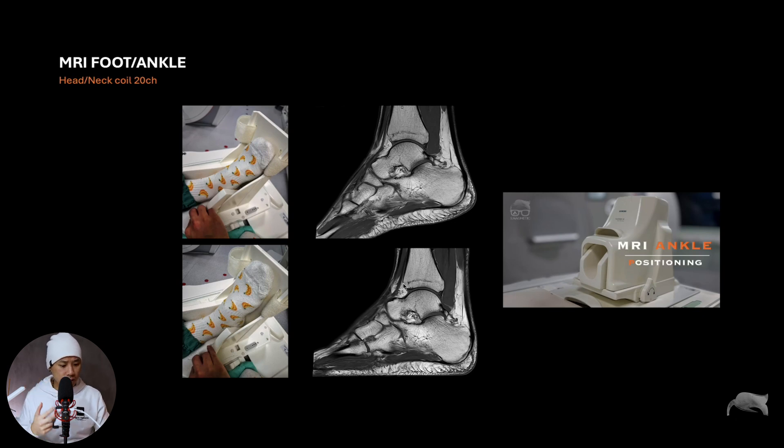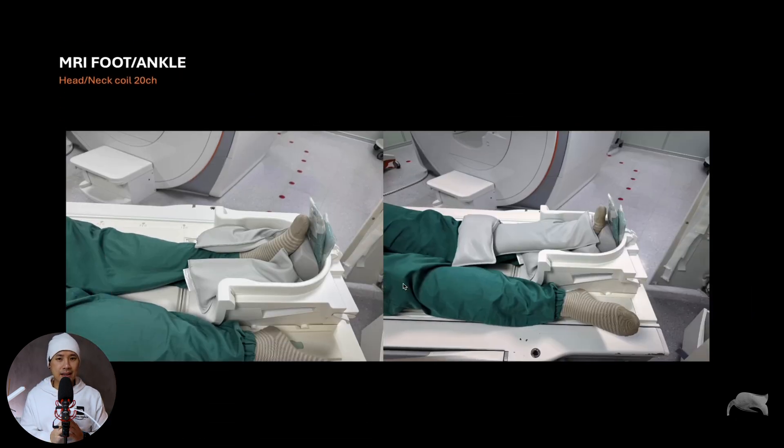As you can see, this was my first attempt. I built up with some cushions to have the foot lying as comfortably as possible at more of a 90-degree angle. I used sandbags to fixate the position and tried to keep everything as still as possible to get the best results.